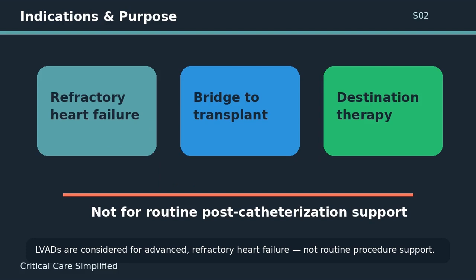LVADs are not routine cardiac procedure support. They are considered for advanced refractory heart failure. Some patients receive an LVAD as a bridge to transplant, meaning the device supports them while they wait for a donor heart. Others receive it as destination therapy, meaning long-term mechanical support when transplant is not an option.